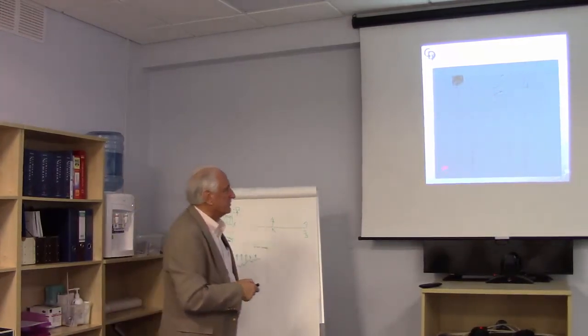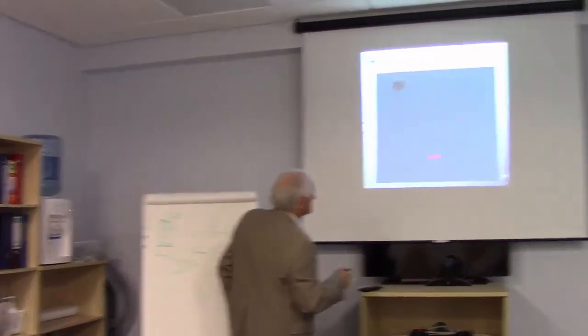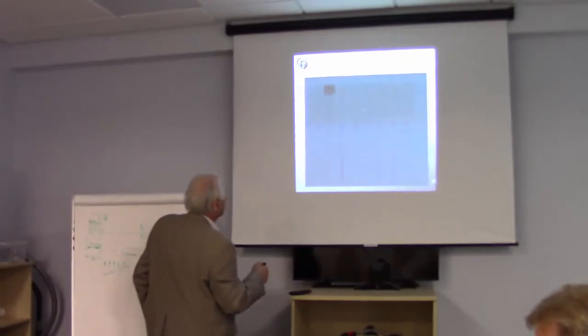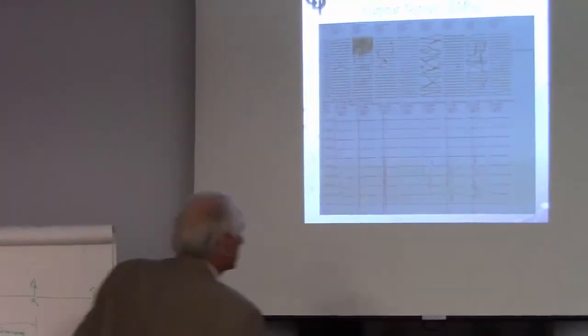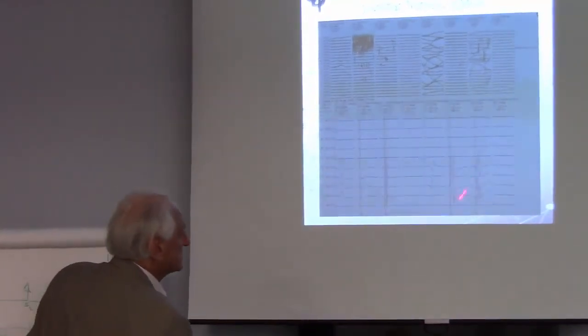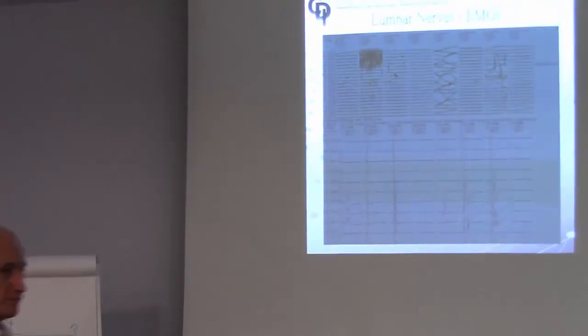And then these are evoked EMGs. I think these were from pedicle screw placement. And I can't actually see which muscle groups those were, but there were a whole bunch of muscle groups, and you can see there's some strong compound muscle potentials being produced by, in this case, stimulation of pedicle screws. So again, the same kind of stuff we looked at with the cranial nerves.